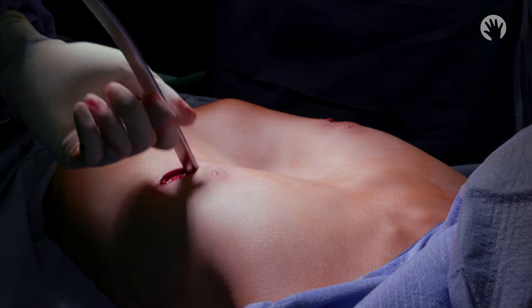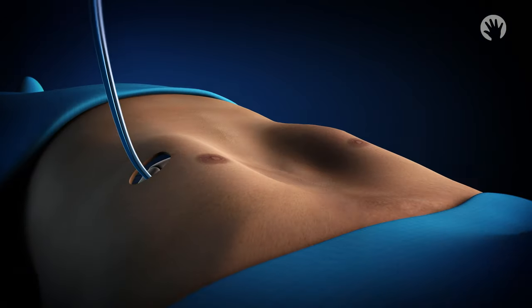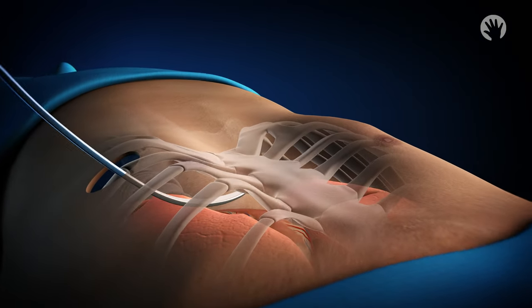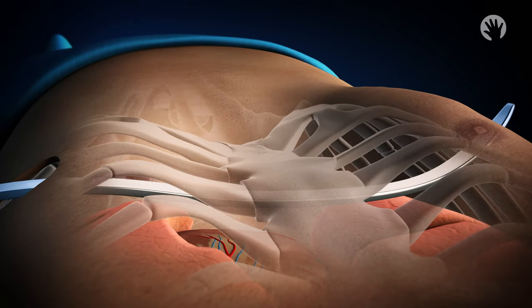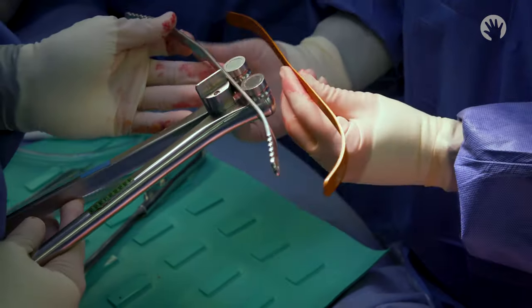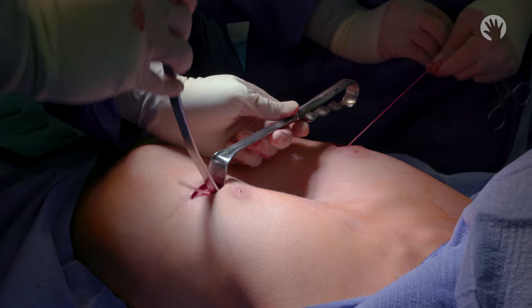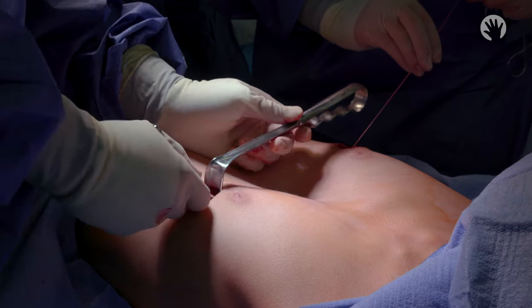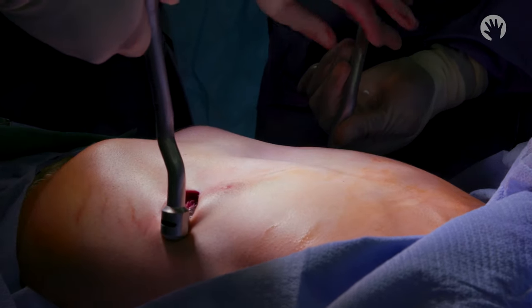Next, we enter the chest cavity through one of the incisions in the rib area and pass a tunneling bar under the skin, behind the breastbone, and in front of the heart. A stainless steel bar is then custom molded to fit the patient's specific chest size. It is then passed across the chest again and flipped into position, providing immediate sternal improvement.